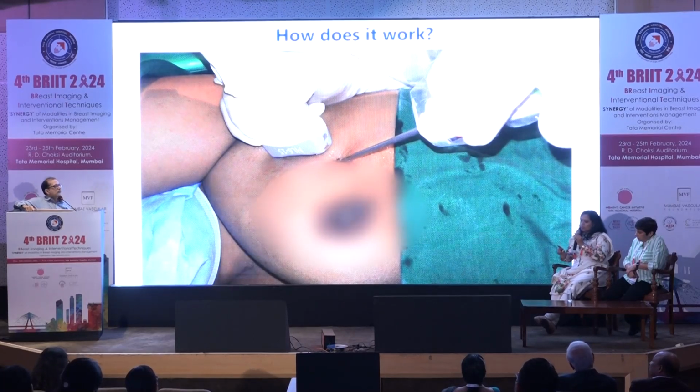So we always use a spinal needle loaded with saline mixed with anesthesia, go to the posterior aspect and see whether the site of entry is optimal before making a skin incision, so that we don't have to repeat the skin incision.